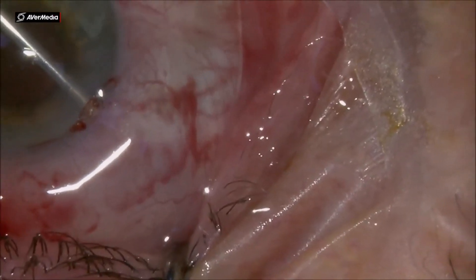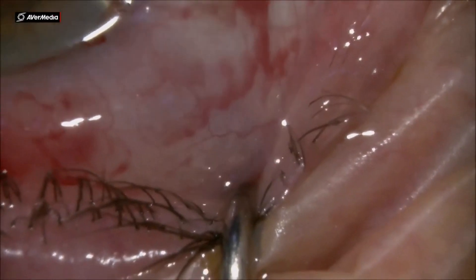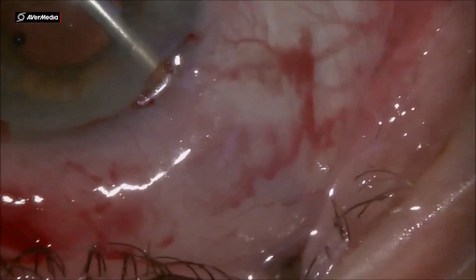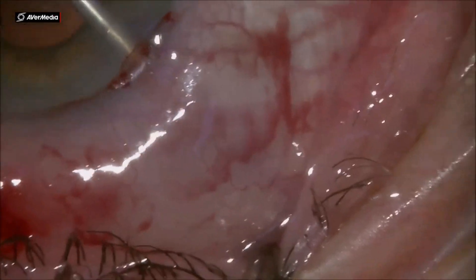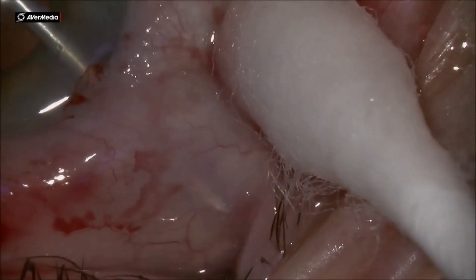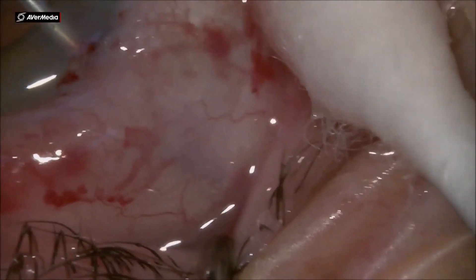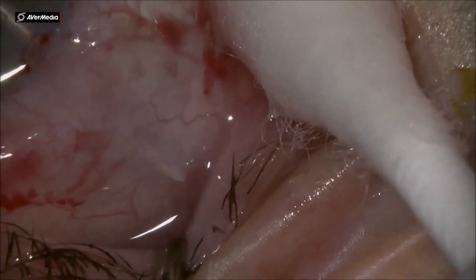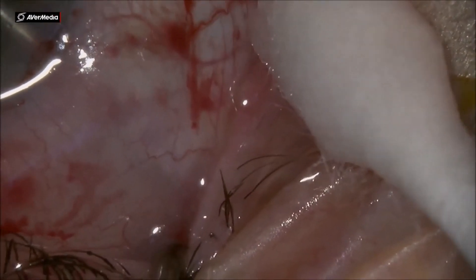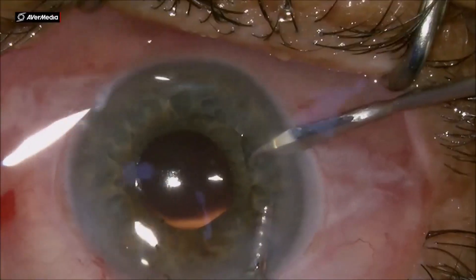By rotating the needle, you create a tunnel going from the anterior chamber down to the sub-conjunctival space. In this case we can see the tip of the needle right underneath the tenon space — you can see it turning. You can go underneath the sub-tenon area or you can go above tenon, depending on where you inject the BSS or the anesthesia to raise the conjunctiva beforehand.